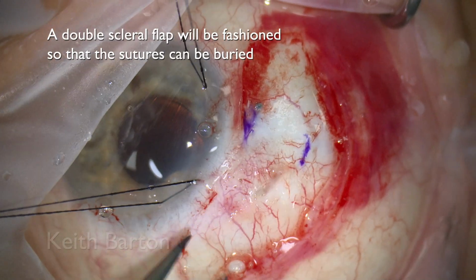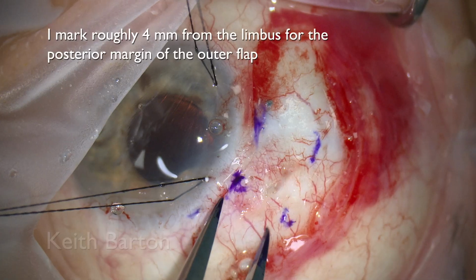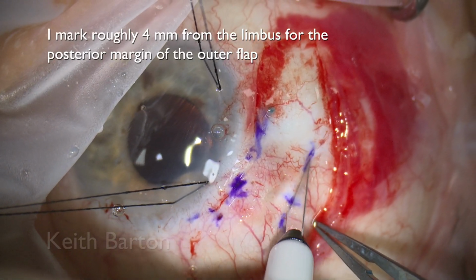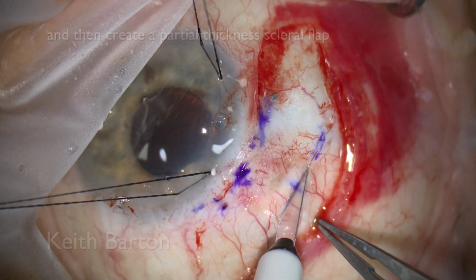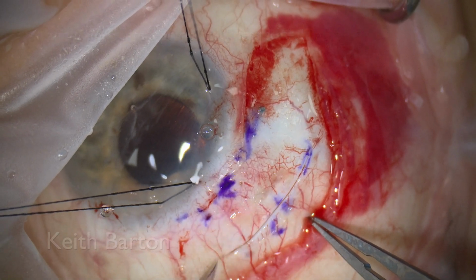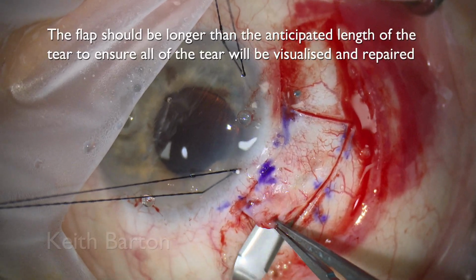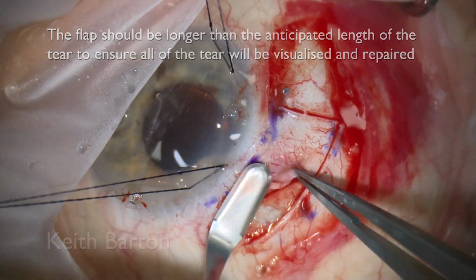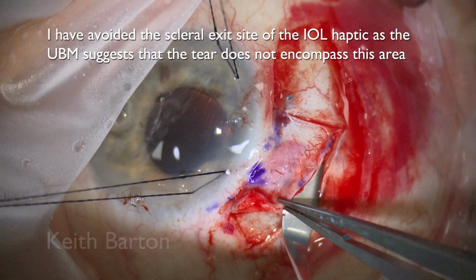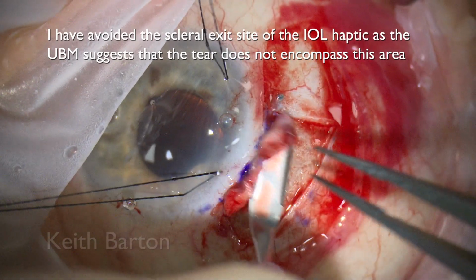A double scleral flap will be fashioned so that the sutures can be buried. I mark roughly 4 mm from the limbus for the posterior margin of the outer flap, and then create a partial thickness scleral flap. The flap should be longer than the anticipated length of the tear to ensure all of the tear will be visualized and repaired. I have avoided the scleral exit site of the IOL haptic as the UBM suggests that the tear does not encompass this area.